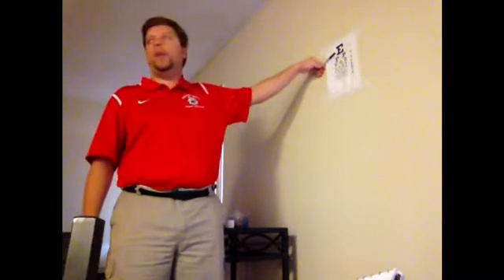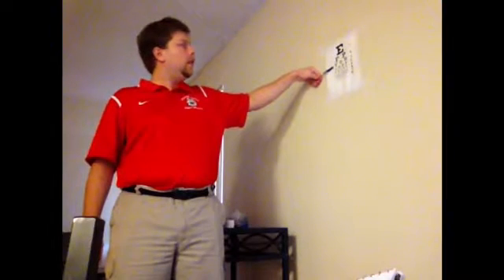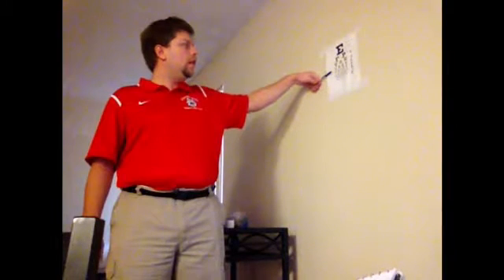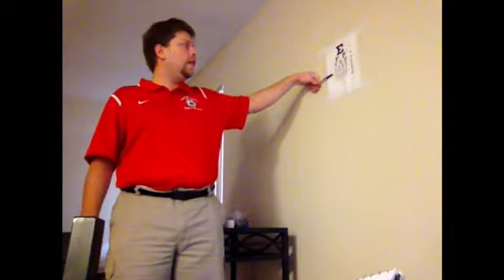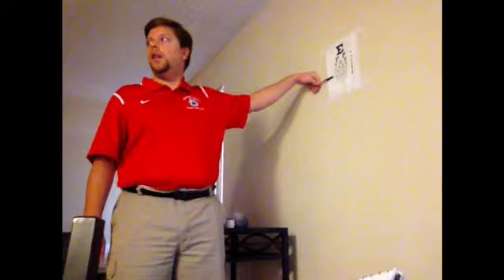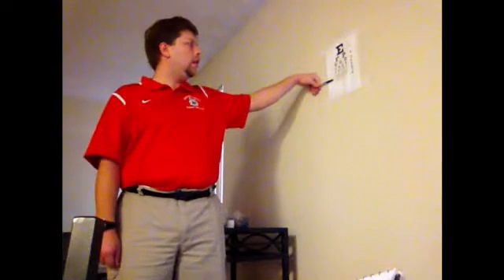Go ahead and read line 1. E. Line 2. FP. Line 3. TOZ. Line 4. LP ED. Okay. Line 5. PE CFD. Line 6. EDF CZP. Okay, and then line 7. FEL.